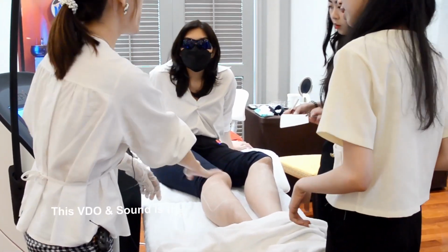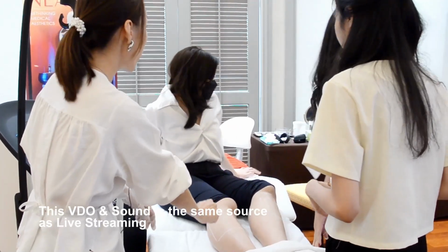So next you need to apply the ultrasound gel. It's over there.